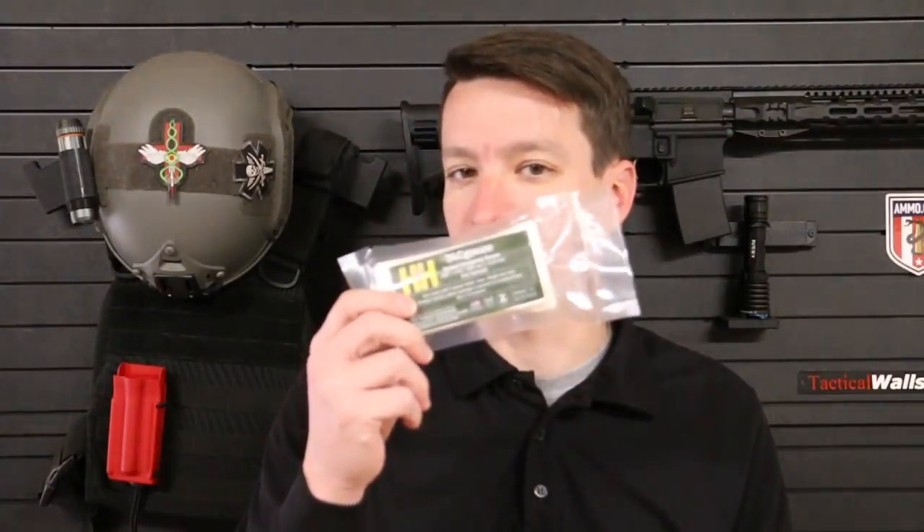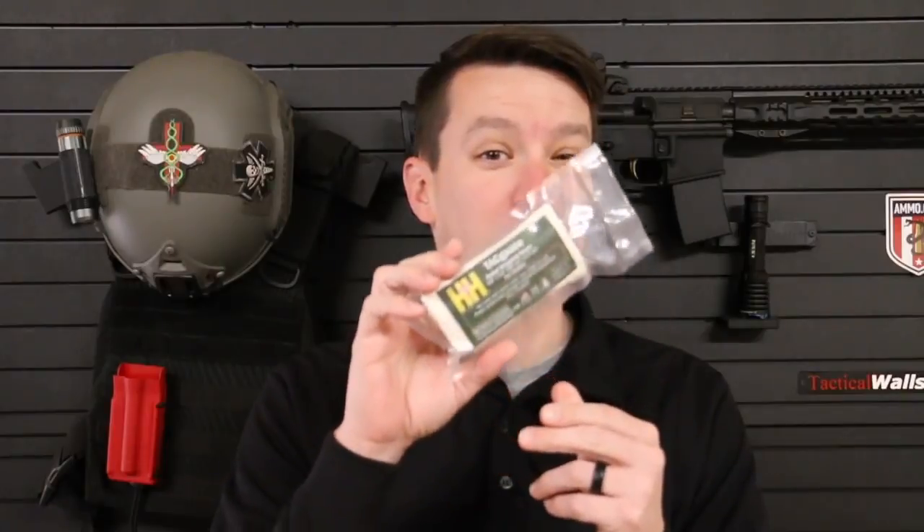Welcome to another video from Skinny Medic. In this video, I'm going to review a brand new product from H&H. This is their TAC Gauze. This is compressed gauze, but it has a few new features that I think you're going to want to take a look at.